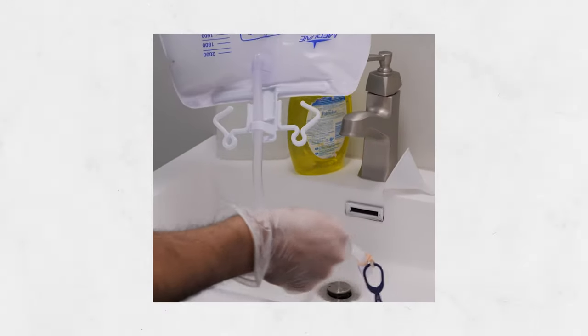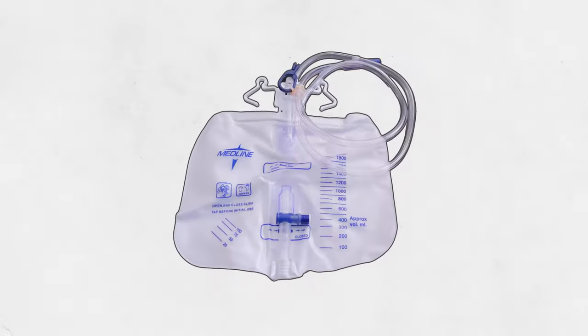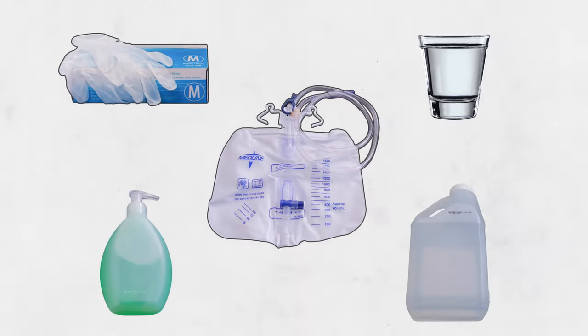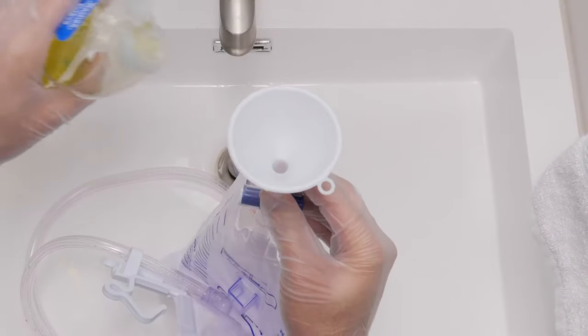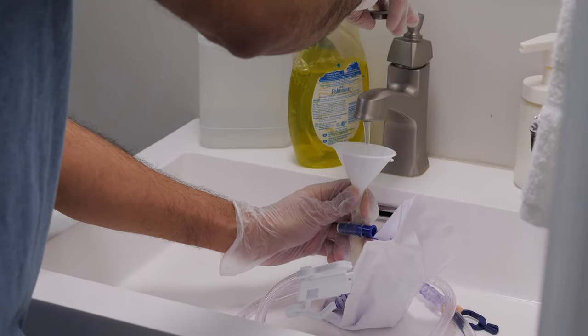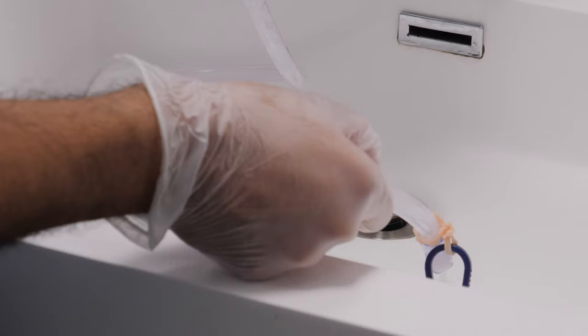Cleaning the bag. To clean a catheter bag, you'll need gloves, soap, water, and white vinegar. A funnel will also be really helpful. Using a funnel, fill the bag with warm, soapy water. Swish it around, then let it drain.